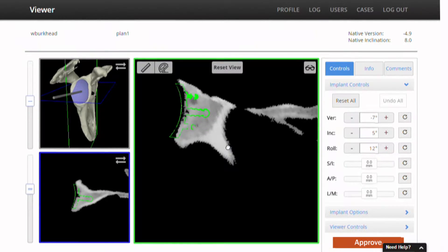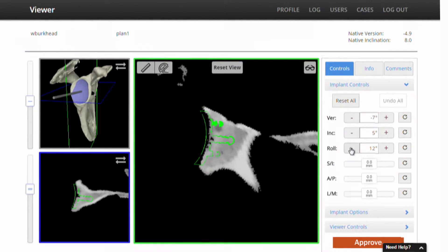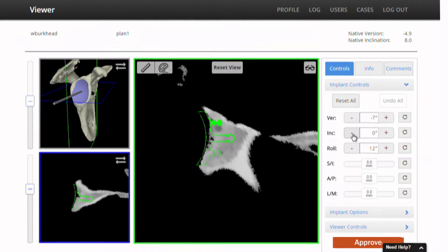Inclination — I'm not a big believer in having any superior tilt on any kind of glenoid component, so I'm going to take the inclination out of this. I'm going to go ahead and angle the implant inferiorly a little bit, back down to pretty much zero degrees, just to avoid any tendency towards superior escape that the component might create.